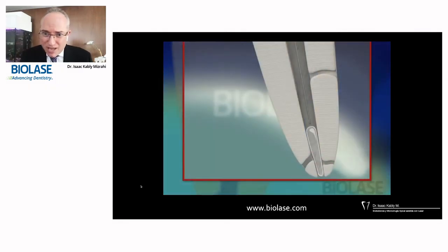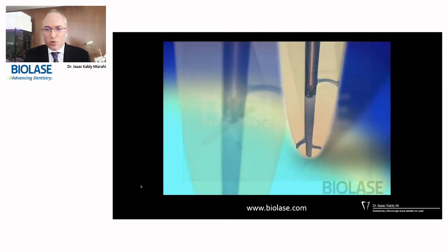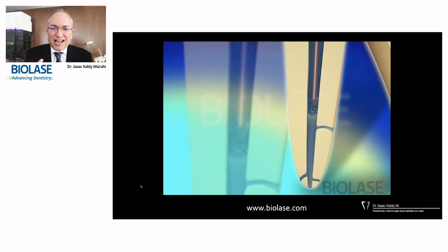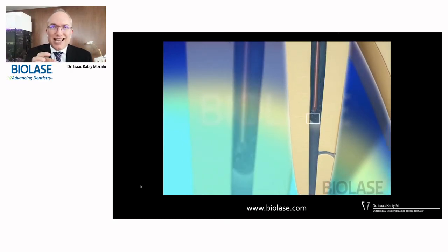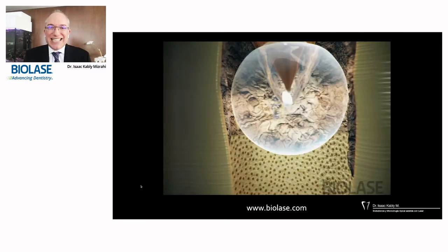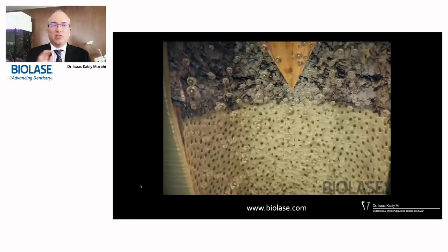So again, in this animation, you will see water, good, no EDTA, no sodium hypochlorite. I love that because it won't irritate and it won't be extruded through the root canal foramina. Now you can see that cavitation effect happening there. And then we can see that radial firing tip touching the walls. This is very important. And then here we can see how laser energy is ablating that smear layer surrounding and blocking the dentinal tubules of the root canals, of the inside of the root canal.